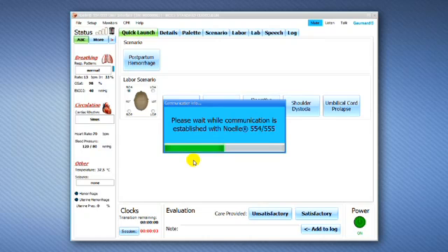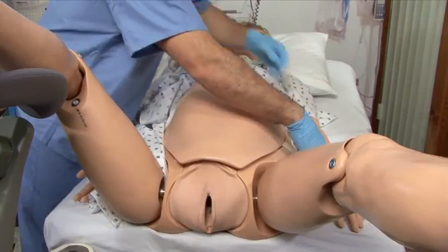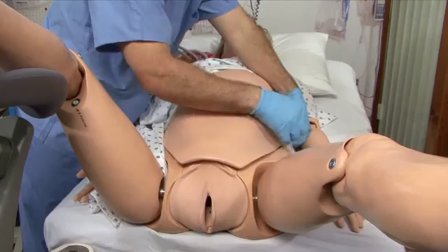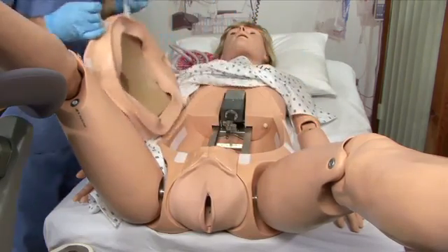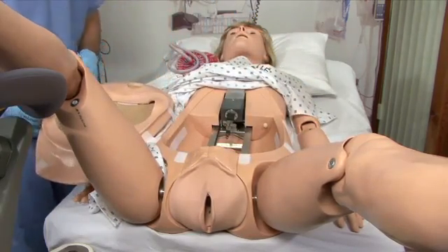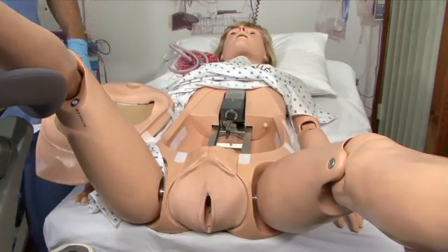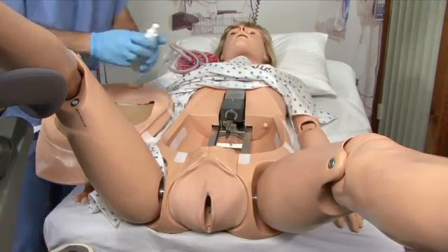On the Virtual Monitor Computer, click the GoMard Monitors icon to open the VitalSign software. Remove the tummy cover and lubricate the birthing canal as shown.